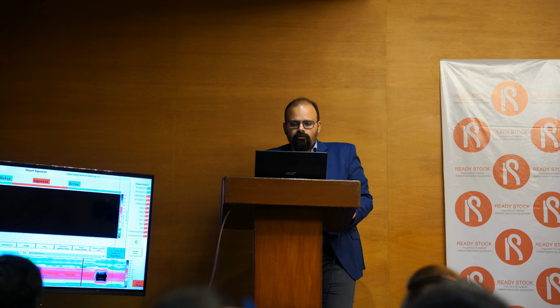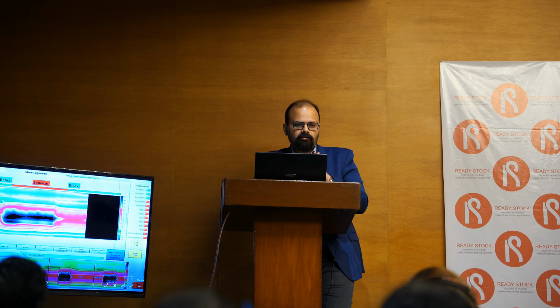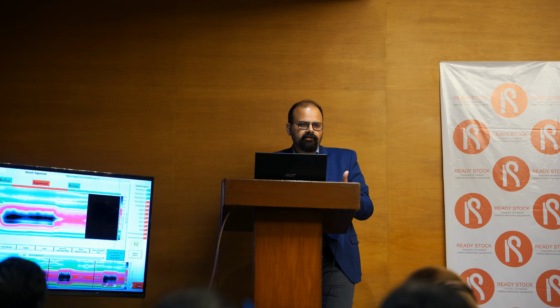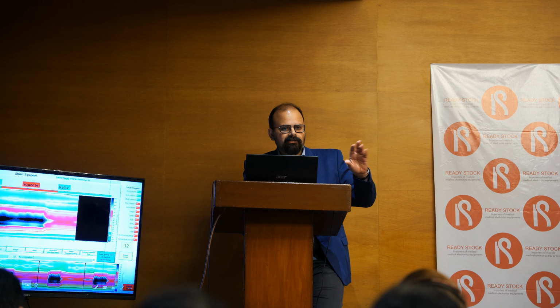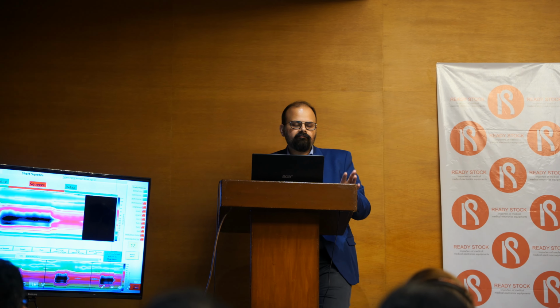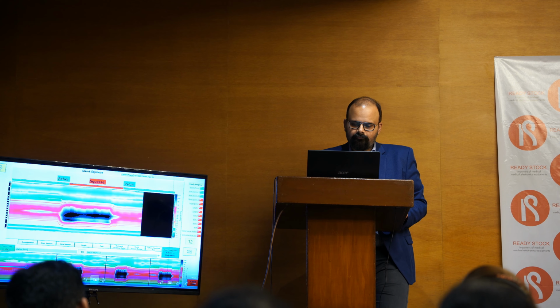It's pretty simple. You ask the patient to squeeze at a particular time. It doesn't exactly have to correlate with where the squeeze is written, but roughly that much duration, around 5 seconds, is important. We do it 3 times. Why 3 times? At least you get a decent number of recordings. It can be 4, it can be 5 if you feel that you are not getting a good value, but as per the protocol, at least 3 values is something you should be doing in every case. Can be more. In case you are doing it for incontinence, you can do it more.